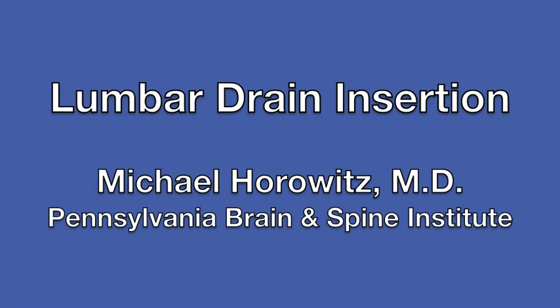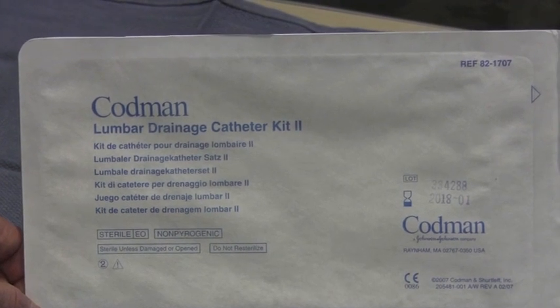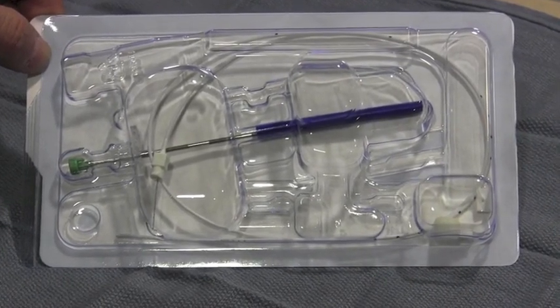Lumbar drain insertion on a model performed by Michael Horowitz. This is the lumbar drain package with all of the components. Here are the components for the lumbar drain insertion.